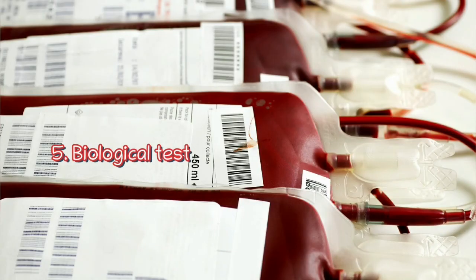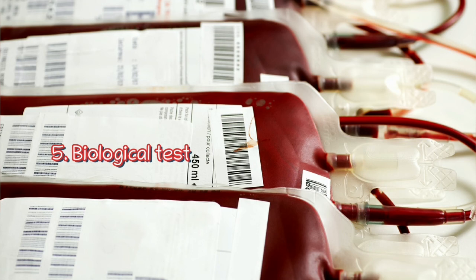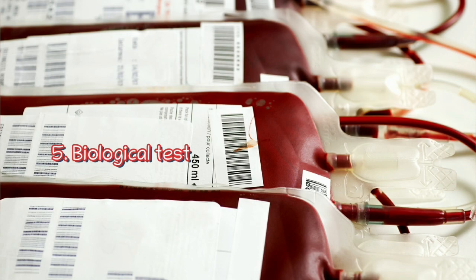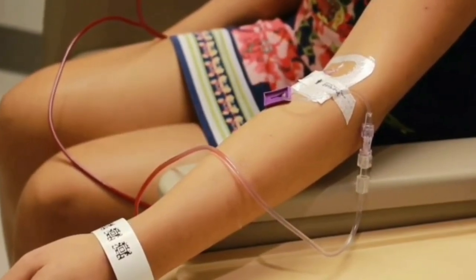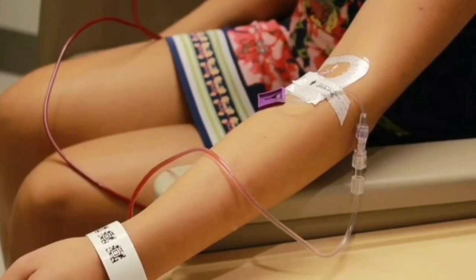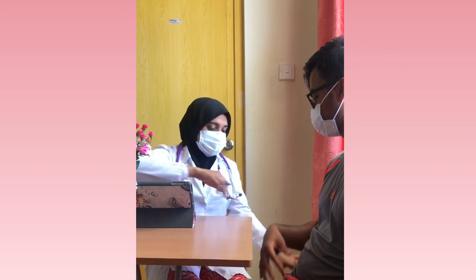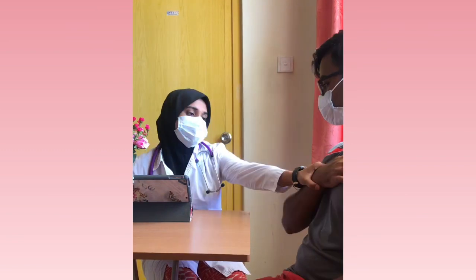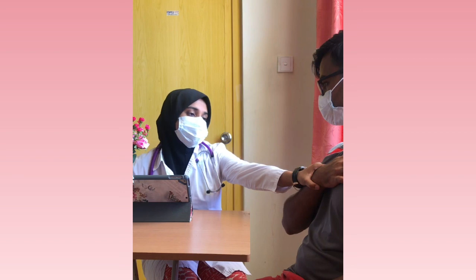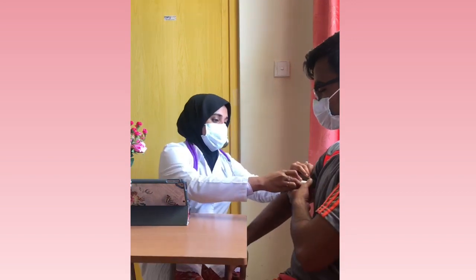The last test is the biological test. Before starting, the container with transfusion medium should be kept at room temperature for 30 minutes or warmed in a water bath at 37°C. Then 10 milliliters of transfusion medium is infused at two to three milliliters per minute, and the transfusion is stopped. The recipient is observed for three minutes, with a physician checking pulse, respiration, blood pressure, general condition, skin color, and body temperature. This is repeated twice more. If symptoms such as chills, back pain, burning sensation, chest tightness, headache, nausea, or vomiting occur, the transfusion must be stopped immediately.